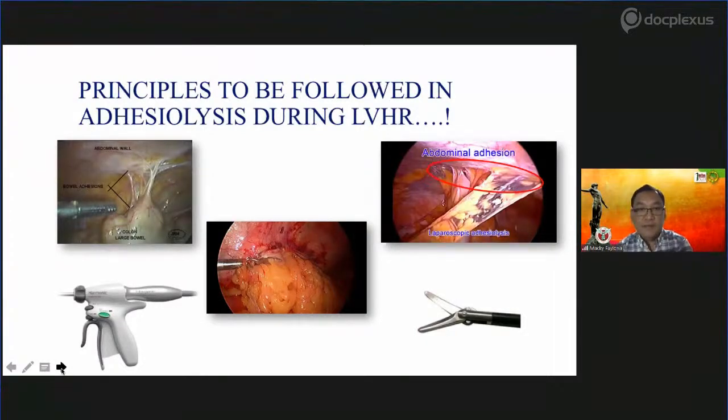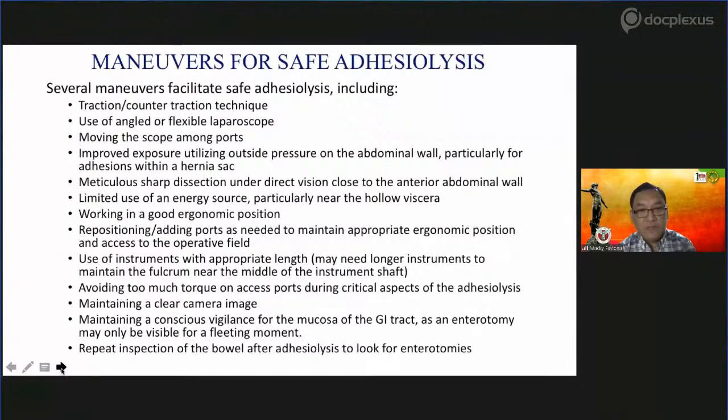or fat. And I try to shift the camera every now and then to see the different views, because sometimes you are cutting omentum but there's a bowel at the back and you won't be able to see it. So just follow the same principles as in open surgery. You use cold scissors to cut everything. Exactly. Any other, sir? Any other opinion?